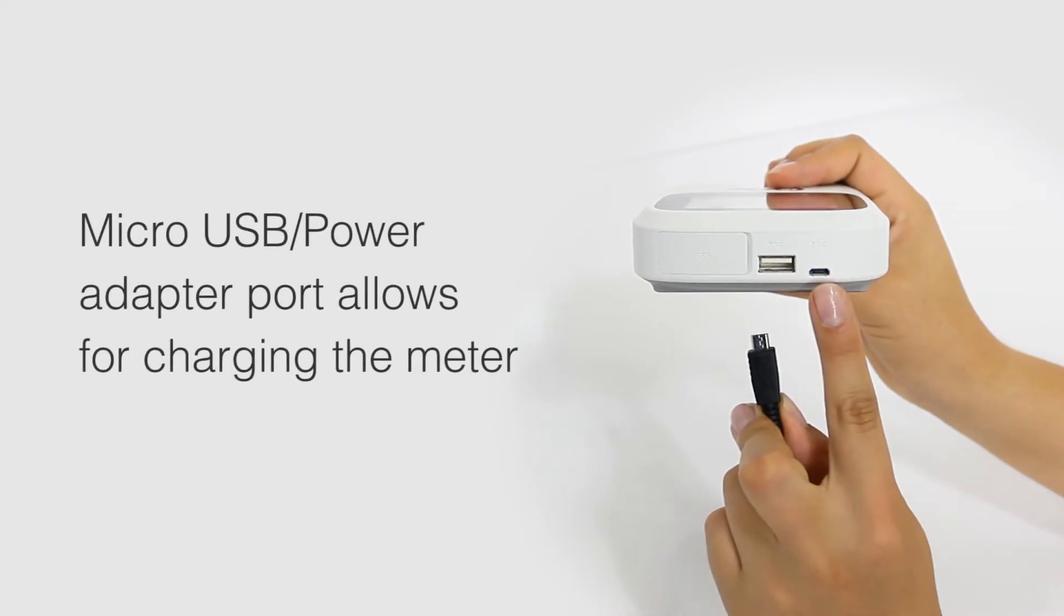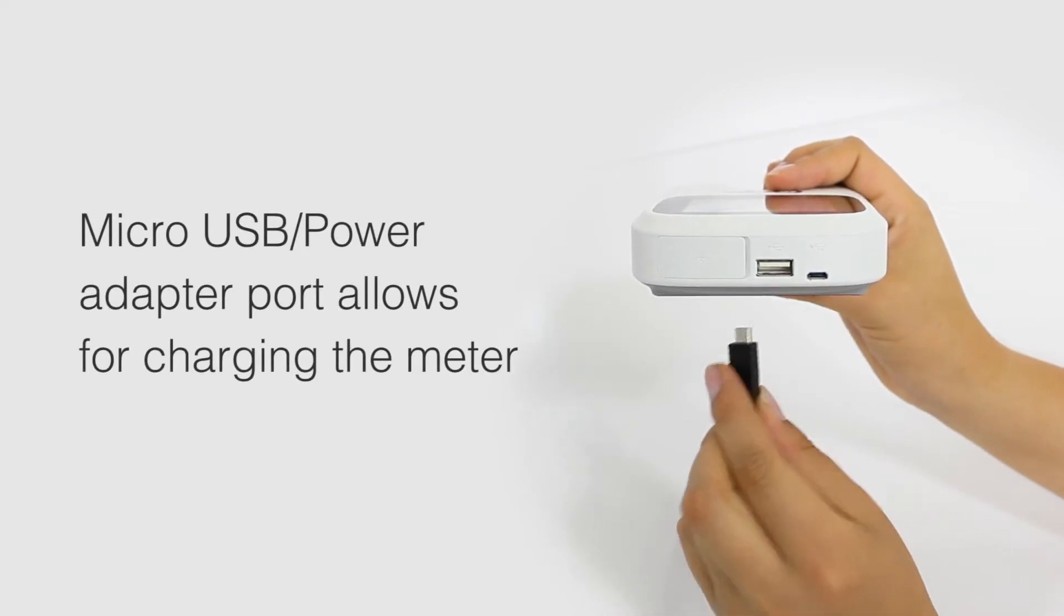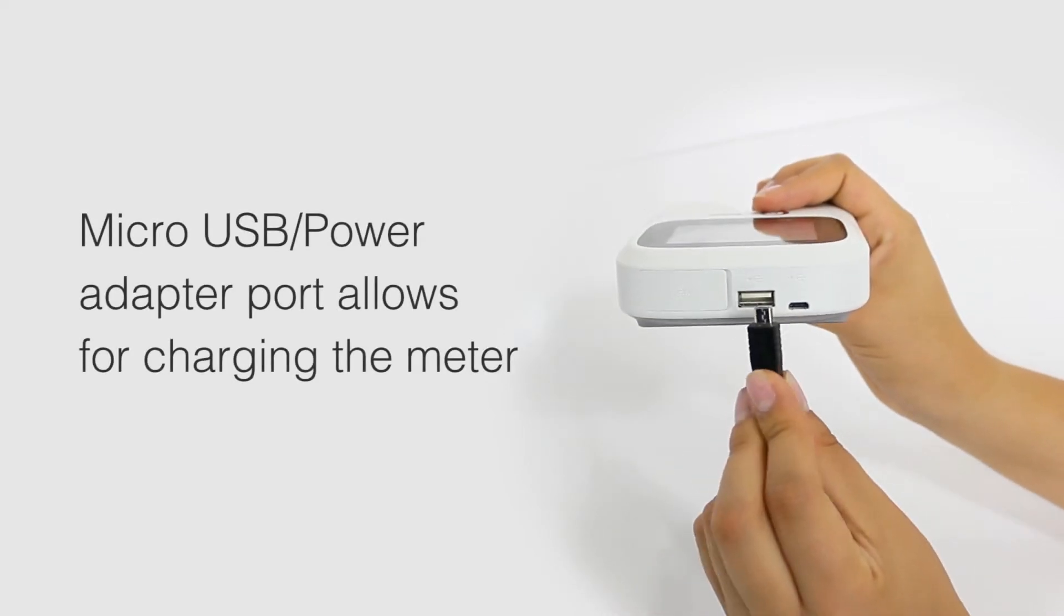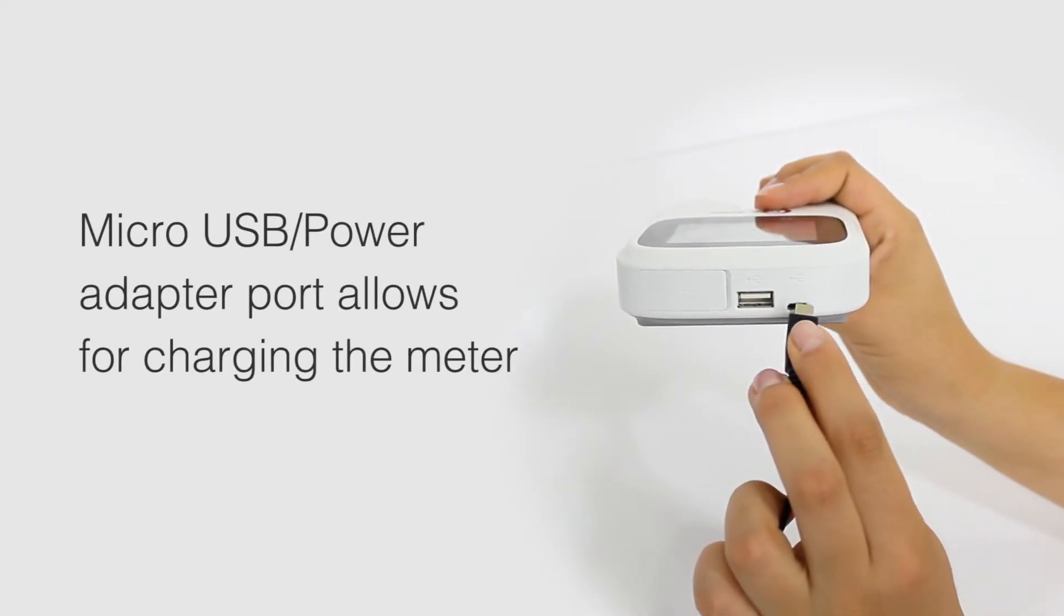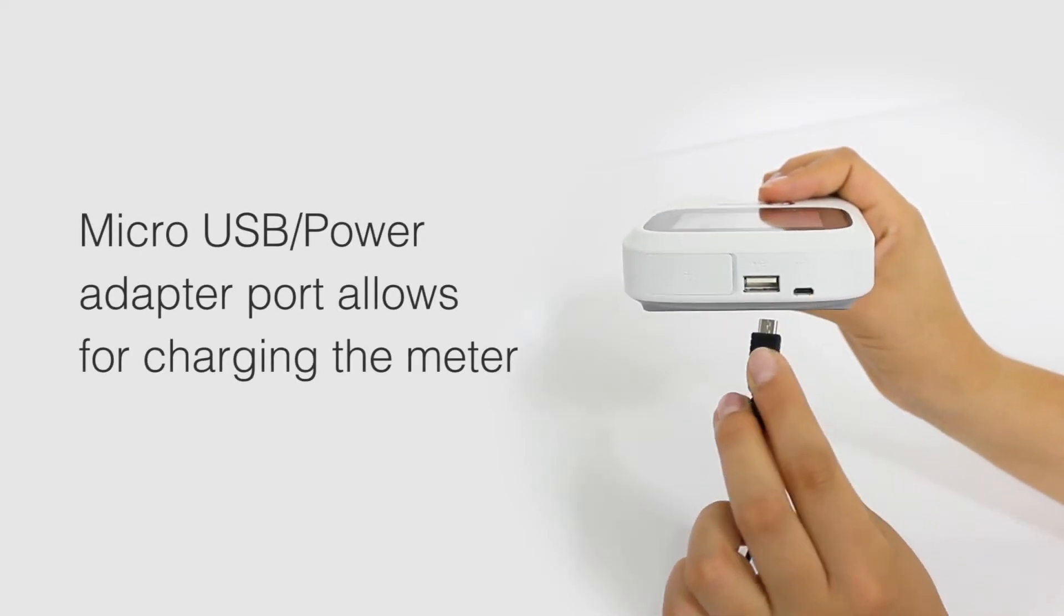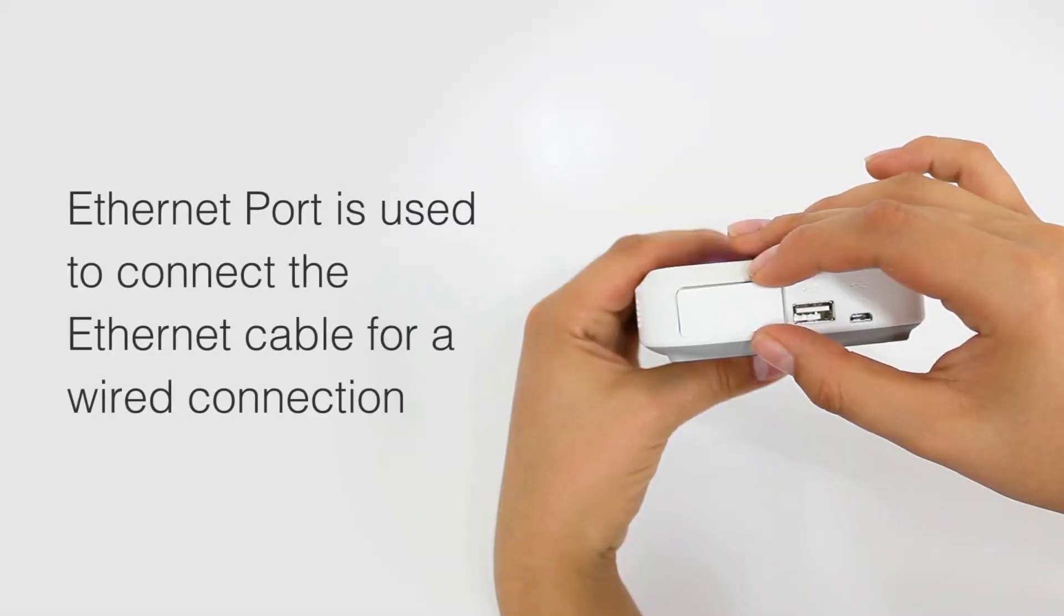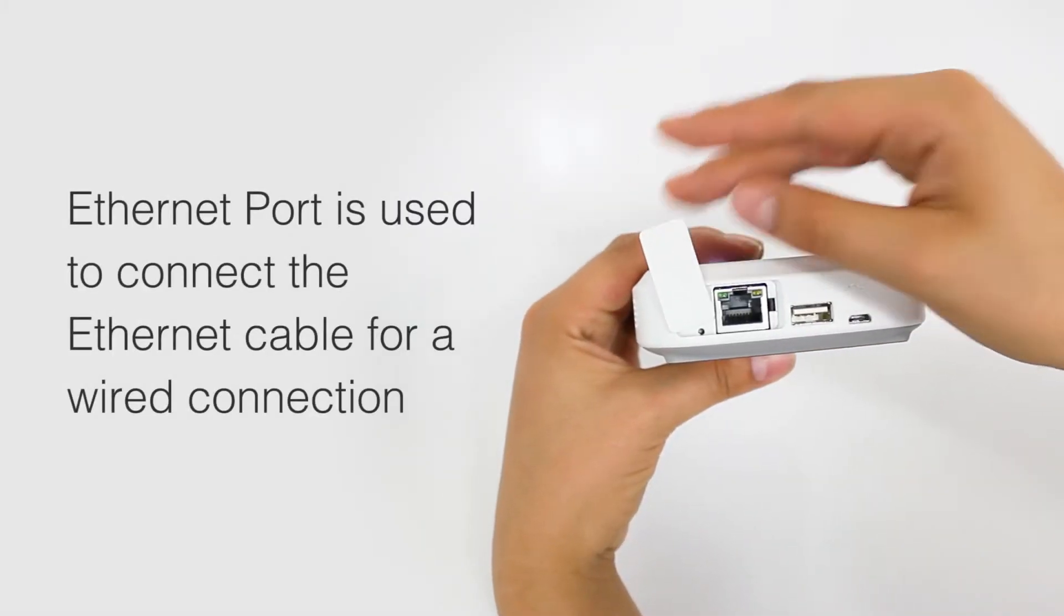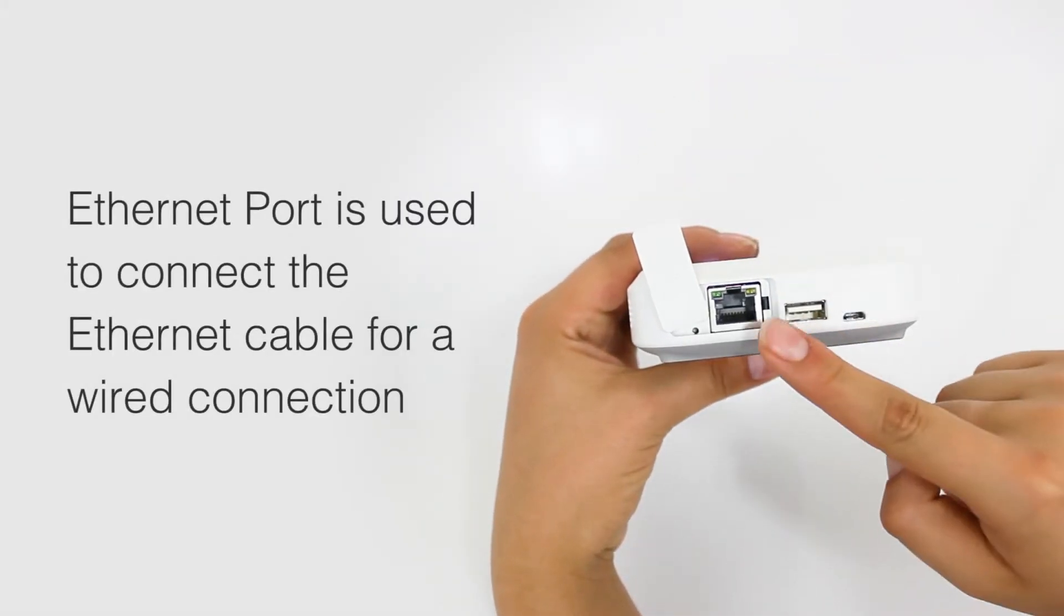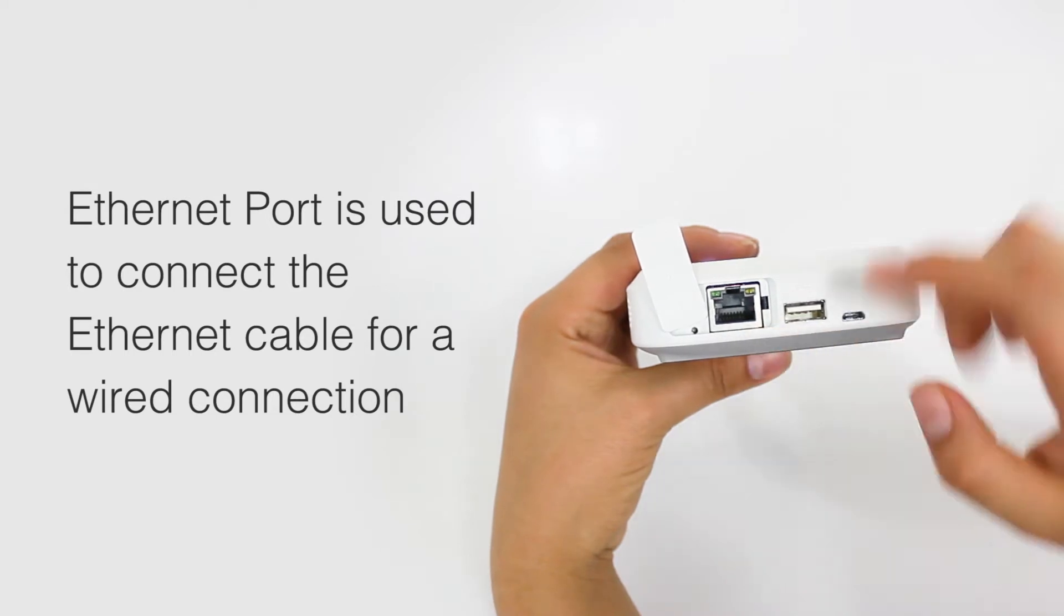Micro-USB power adapter port is a micro-USB port for the power adapter. Ethernet port is used to connect the Ethernet cable for a wired connection.